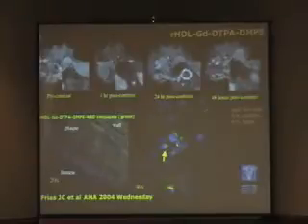Okay, I guess, because PK is here, we're very excited about our work with the HDL-like particle. This is using a natural lipoprotein to carry the gadolinium and to target it specifically to the vessel wall itself. I know Sam Semikas is also in the audience. He's been doing also work with nuclear imaging and molecular imaging. So this is the MRI approach. And what's interesting about this, and this is now using the HDL-like particle, is that it behaves like HDL itself. And you can see that with the confocal microscopy here showing cellular uptake in the macrophages.